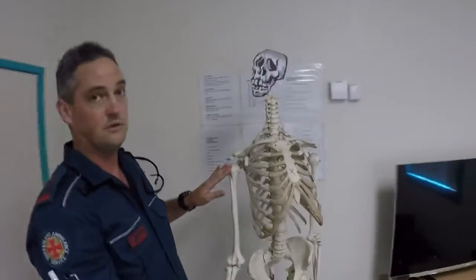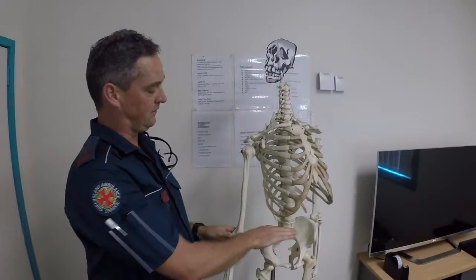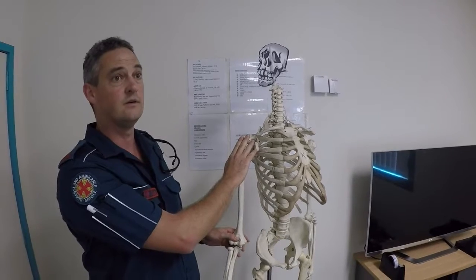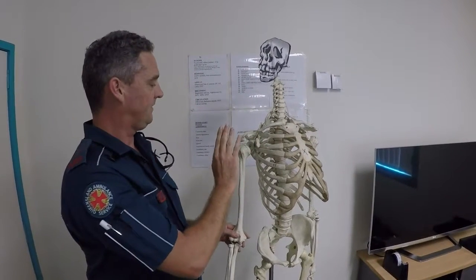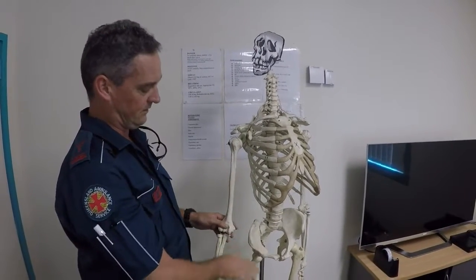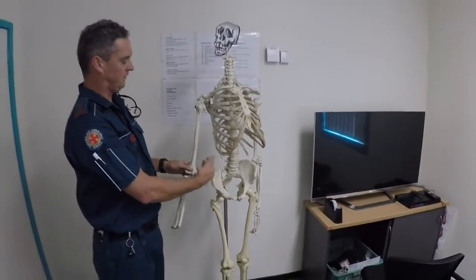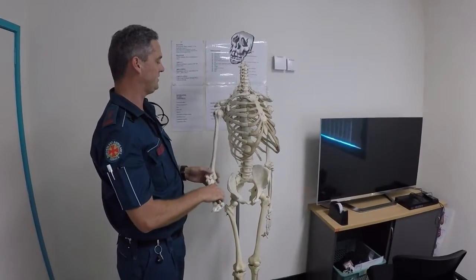The preferred site of administration according to both the Easy IO website and also the QAS CPG is the proximal humerus. The rationale being that it's above the diaphragm, so it's feeding the superior vena cava as opposed to the inferior vena cava. It's also less likely, in the event of a severe trauma where you potentially have pelvic involvement, for venous return to be compromised by inferior trauma in traumatic patients.